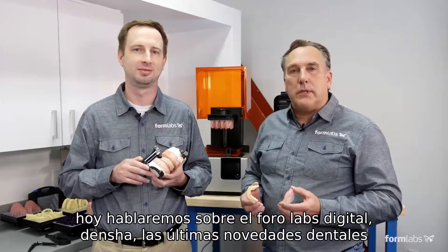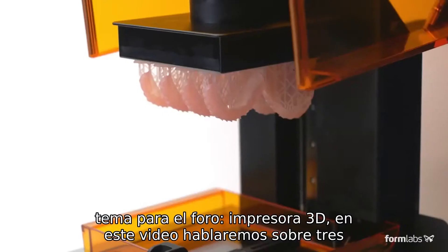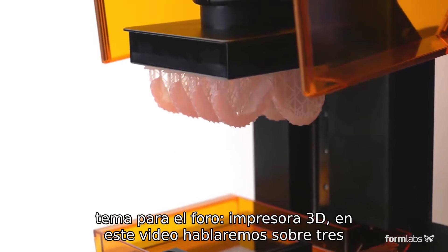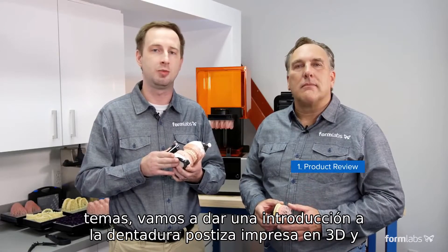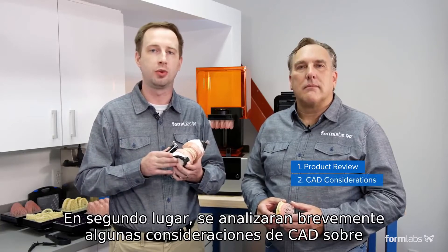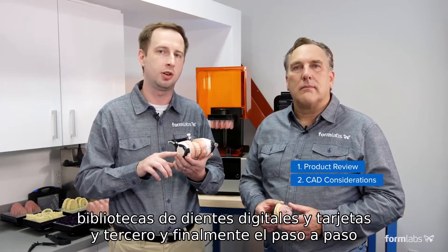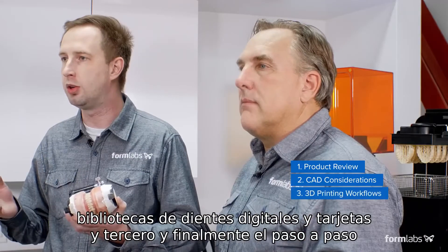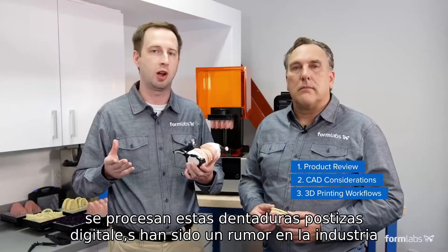Today we'll be speaking about the Formlabs Digital Denture, the latest dental offering for the Form 2 3D printer. In this video, we're going to go over three main topics. We're going to give an introduction to the 3D printed denture and what it consists of. Second, we're going to go through briefly some CAD considerations on digital teeth, libraries, and cards. And third and finally, we're going to go step by step through the manufacturing workflow and how you actually 3D print and process these dentures.